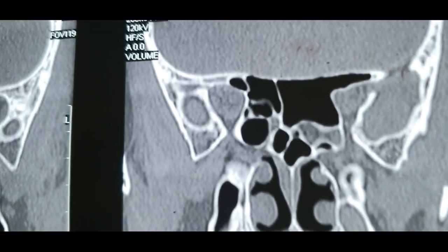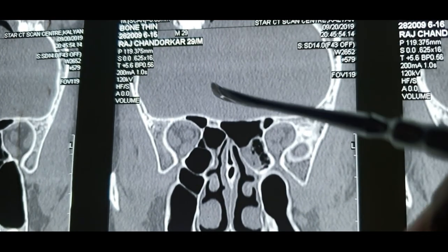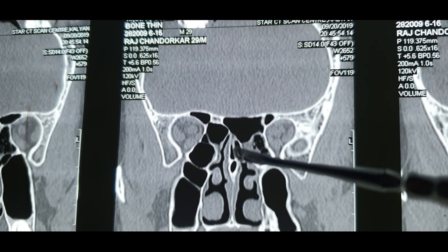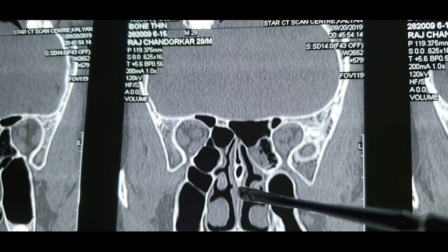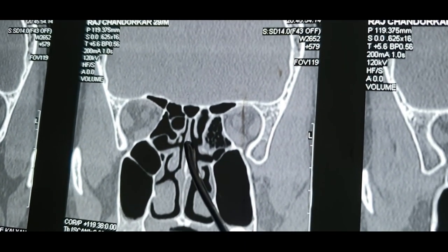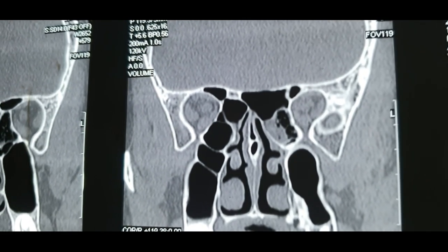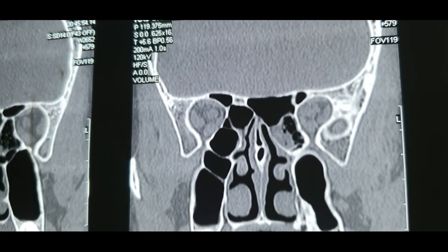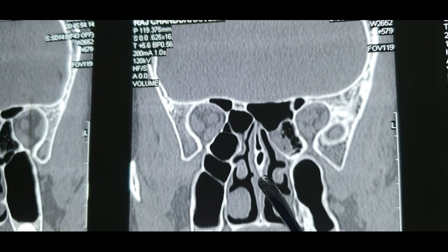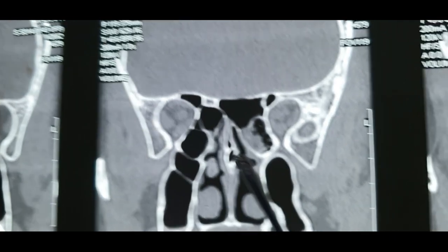Now, this is prior to it. You see, this is a thickening of the area of the septum. See the septum so thin in this region. See this transition. See this septum. And see this sudden thickening of the septum in between. See this? This is the septum, and see this thickening here. This is the rostrum of sphenoid.